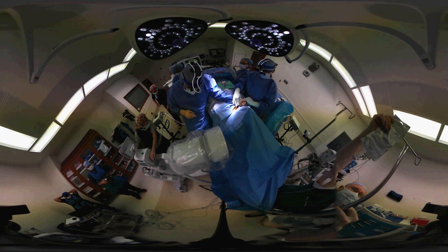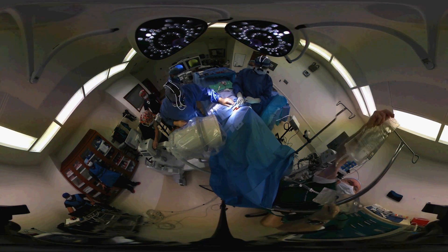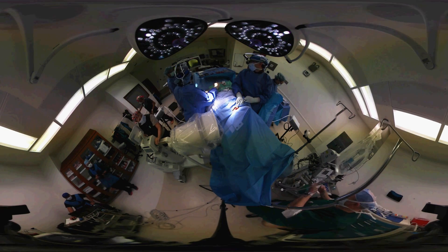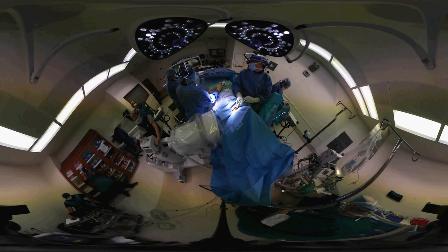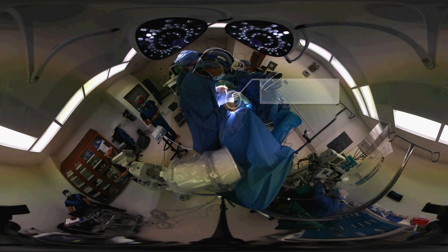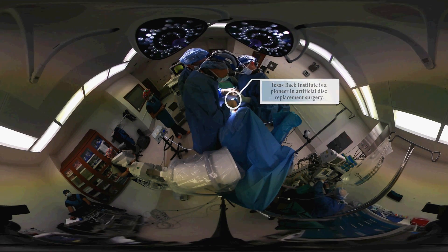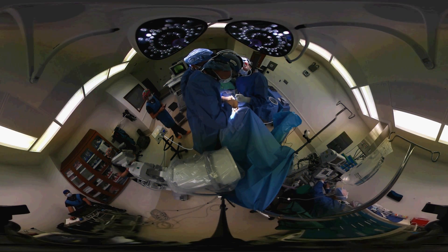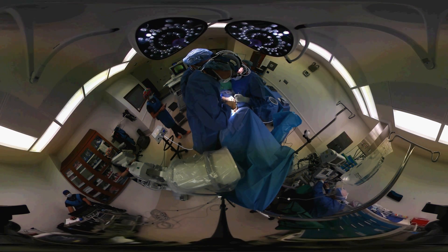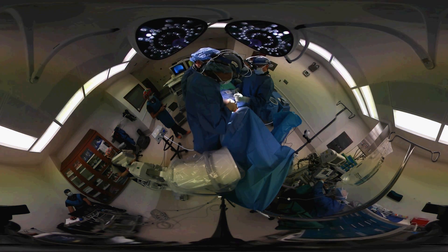We're checking the x-ray to make absolutely certain we are at the right position. Patients sometimes ask how do we know where we are — well, we have your pre-operative x-rays, but then we always verify with x-rays in surgery. This is what we call a C-arm, which is fluoroscopy, and allows us to positively identify the level. Now that everything is in place, I'm actually going to mark the center of the disc. I make a little mark on the front of the spine with an electric cautery that makes a tiny burn mark, but not on any vital tissue, because they're all protected.